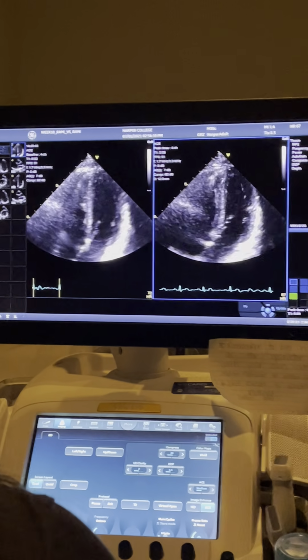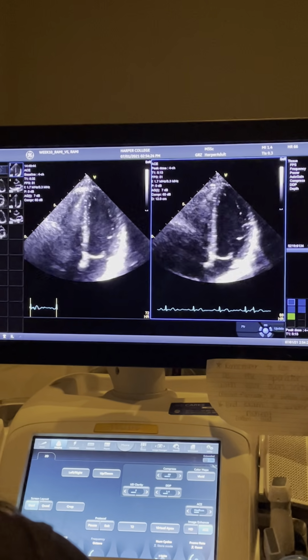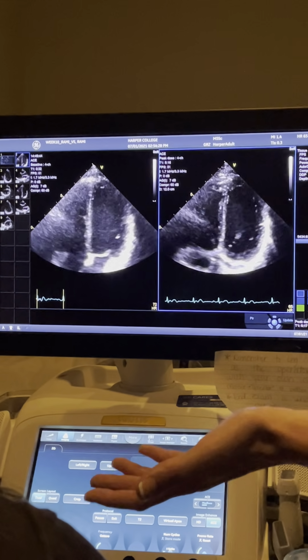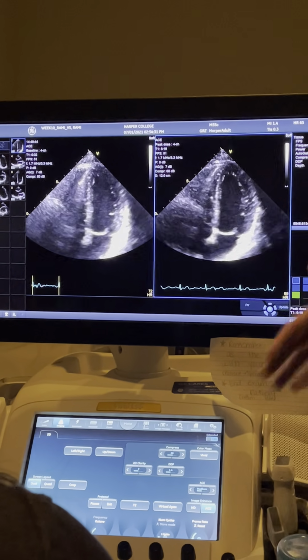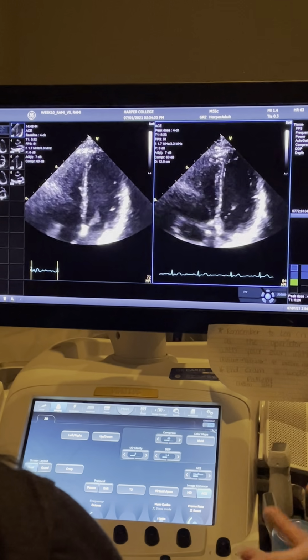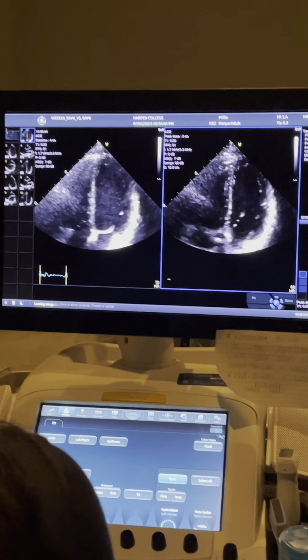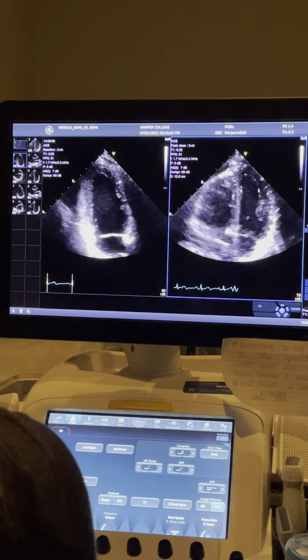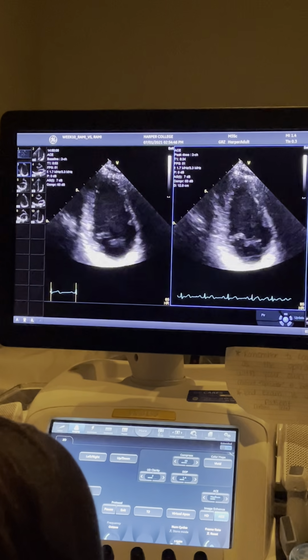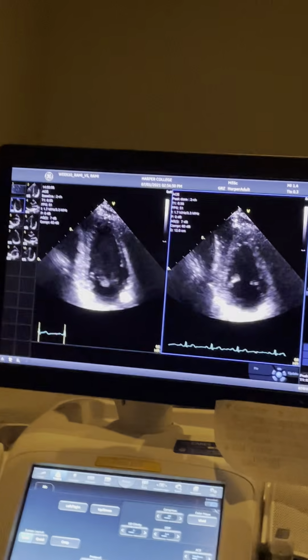But so for these peak ones, most machines now are set up where when you push image store, it does continuous capture. The GE guy dropped this machine off. I didn't have any say in how it's programmed. So actually when you hit acquire, it's going to be the same thing like it was for your low and your baseline. But again, normally there's urgency to get these pictures, and having to acquire and then review and pick one and then go back, that just takes extra time and the patient's feeling like crap. So a lot of places it's continuous capture. But on this it is not.